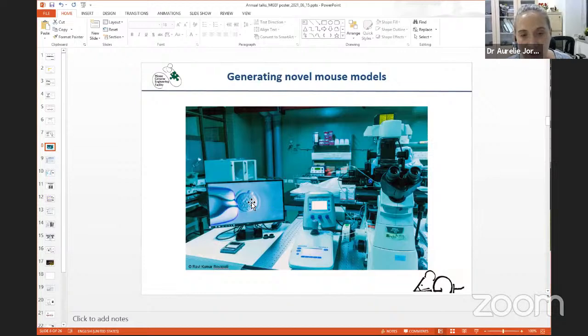And it's going to inject directly either in the cytoplasm or in the pronucleus of the mouse embryo. And then we culture these embryos till the next morning to make sure they survived and they go to the two-cell stage, and we do the embryo transfer that I just talked to you about. And then the live pups are born, and we can analyze them.